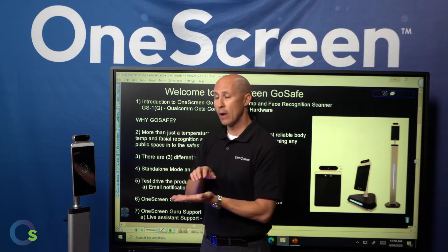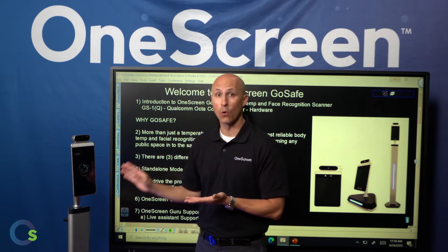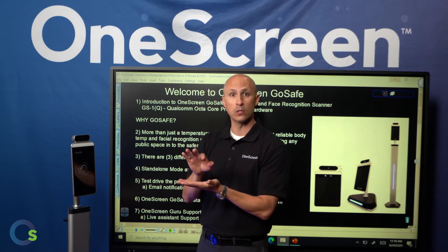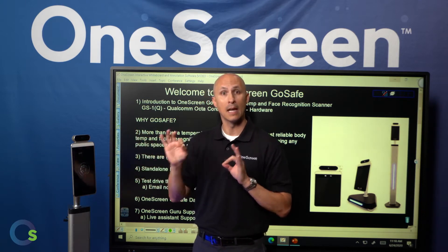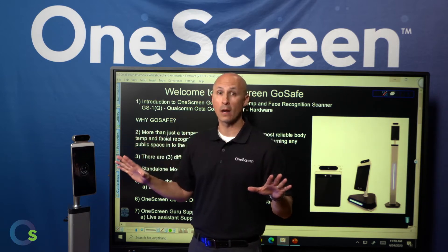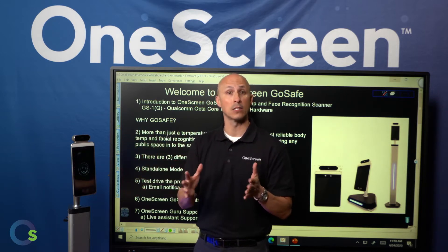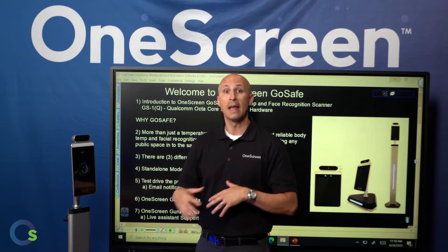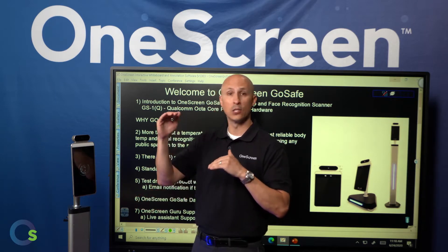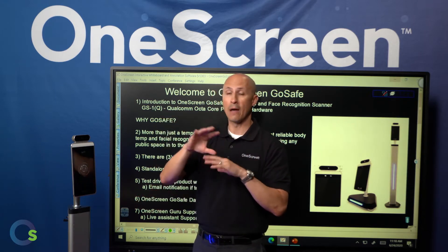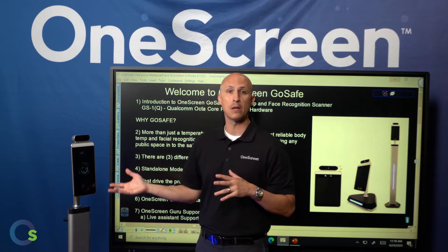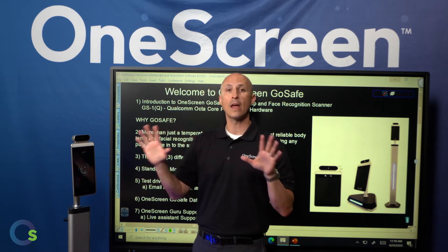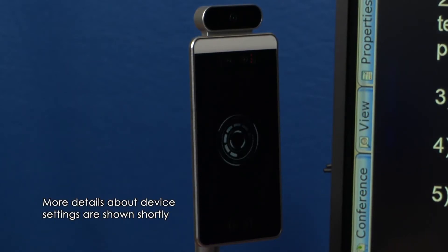Now the way in which you do this is you actually take a mouse, plug it in. It could be a wired mouse or wireless. And as you click on the middle scrolling tool, it's actually going to come up with a password protected area. The great part is not anybody can just walk up to the device with a mouse and gain access. You have to have access to the password. So once you go ahead and put the password in, then you have access to all the different settings at that point. So whether you want to adjust the body temperature settings or having masks on or anything of that nature, even the volume settings as there's speakers built in, password settings, all that can be done directly through the device using a mouse. Now that is the standalone mode.